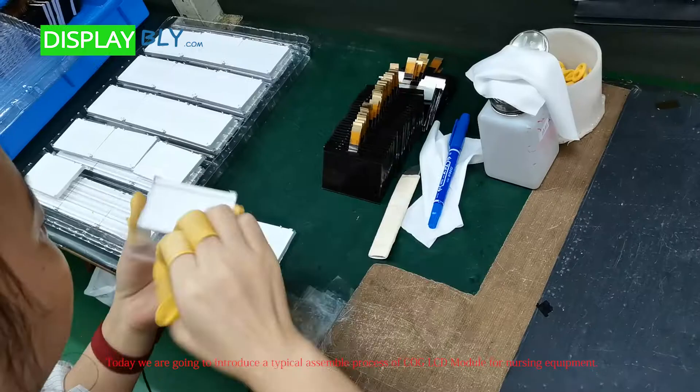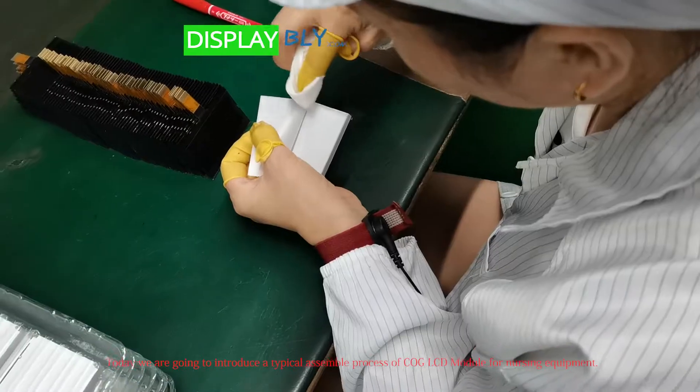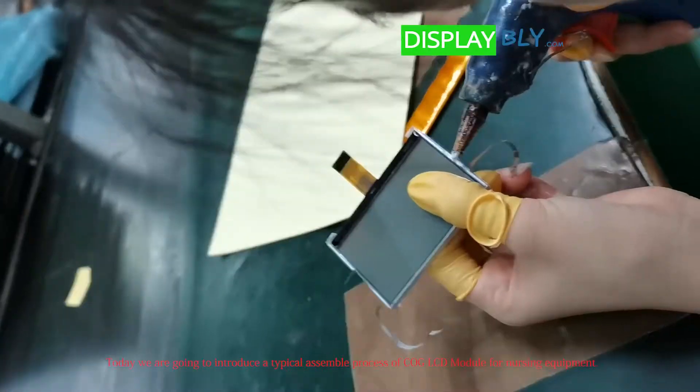Welcome to DisplayBly.com. Today, we are going to introduce a typical assemble process of COG LCD module for nursing equipment.